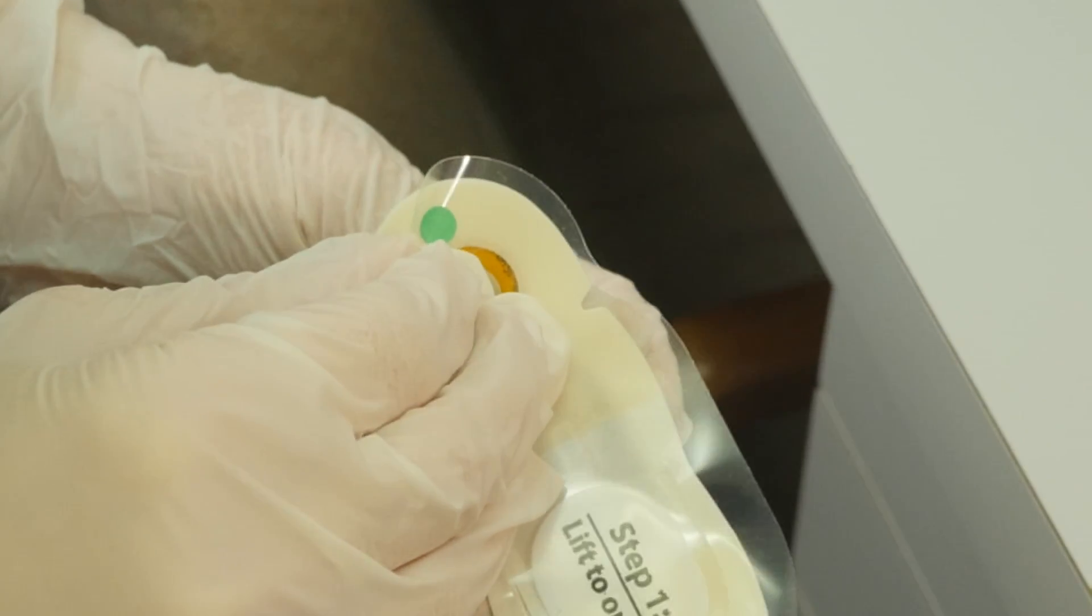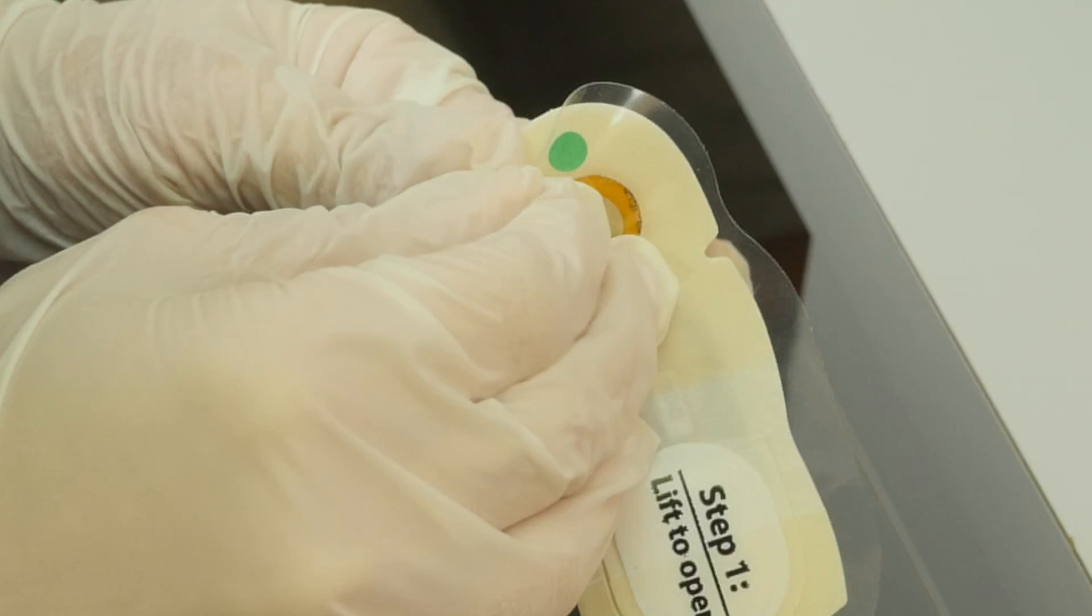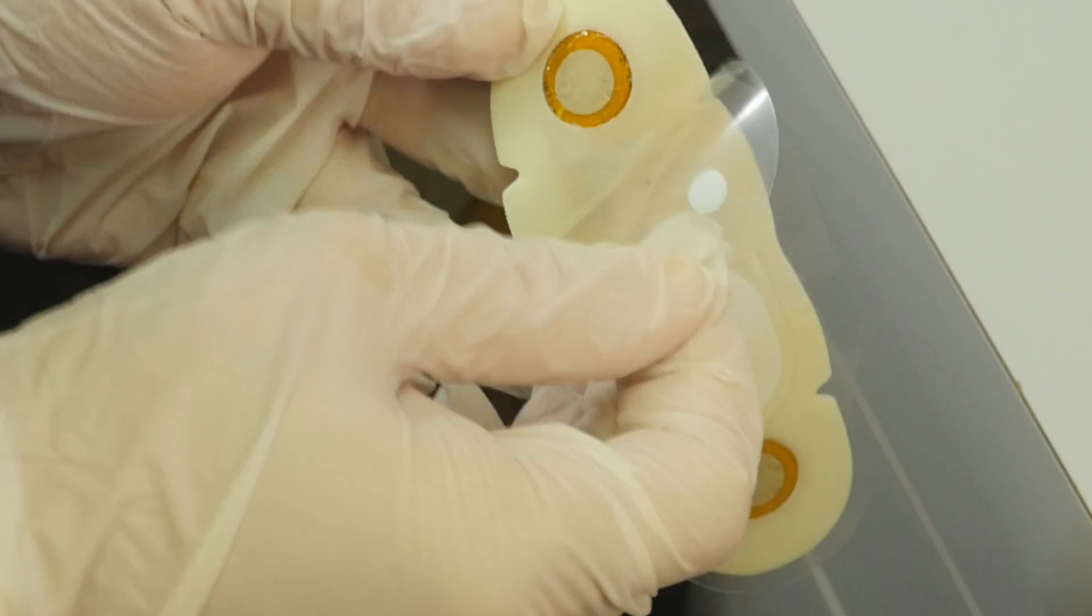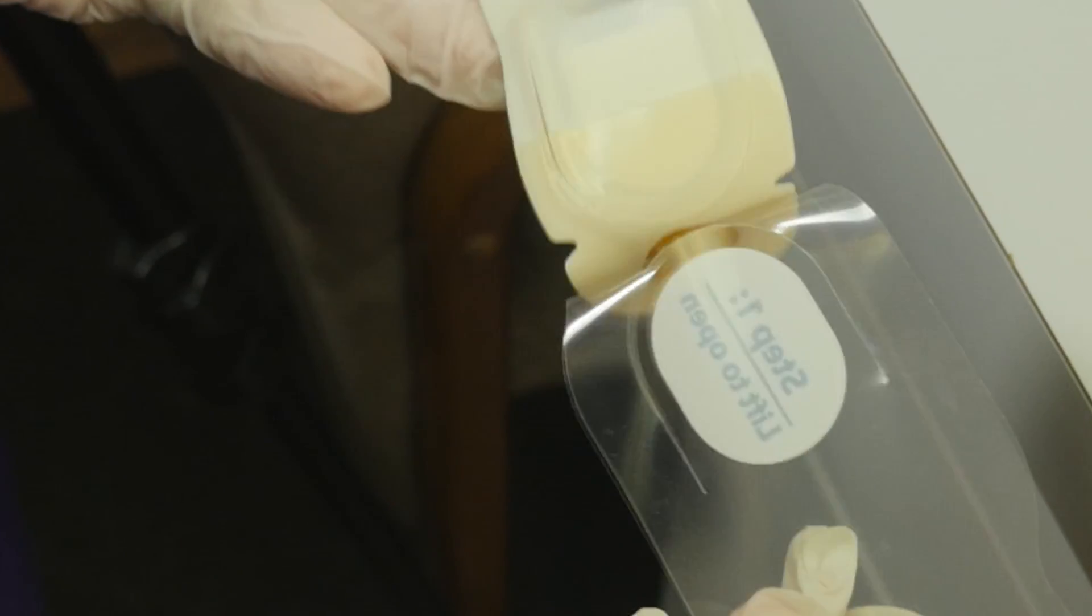Locate the green tab and separate the clear release liner from the patch. Be careful not to touch the adhesive area on the back. Remove the patch.